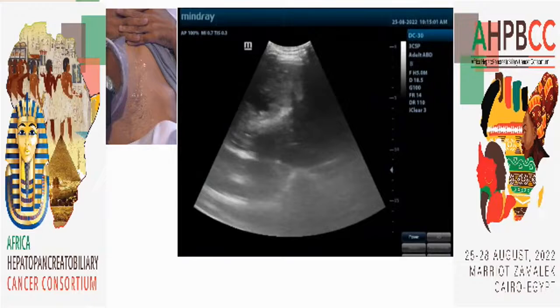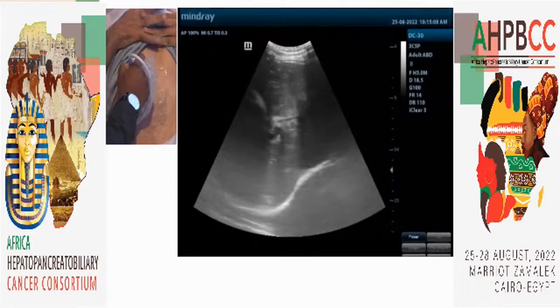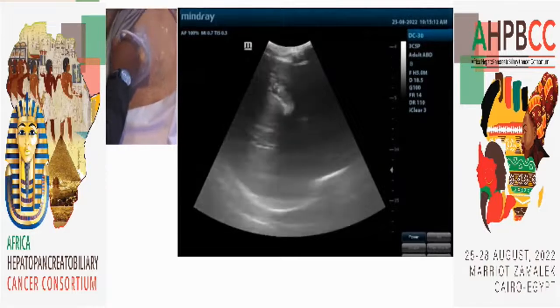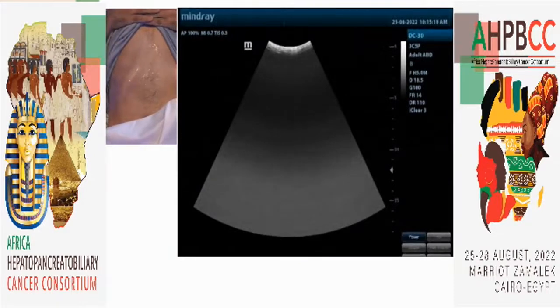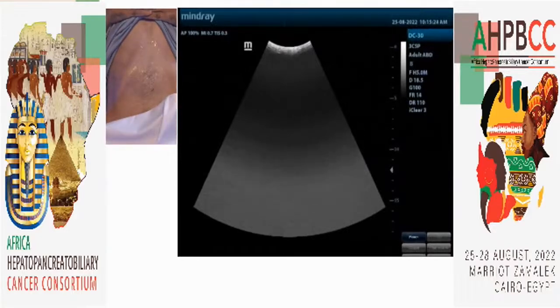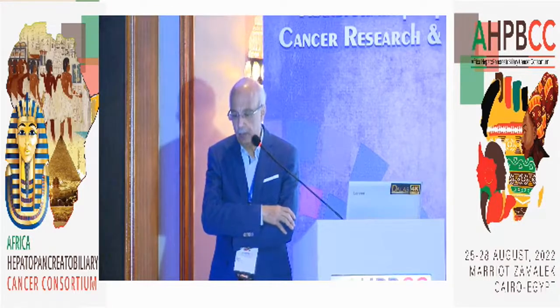Okay. Good. Have you succeeded in getting the focal lesion? We are going to put a score for you. Okay, got it? Good. Oh, great. Under supervision of Professor Yao, of course you got it. Okay, we can move to another case. Thank you very much. Professor Yao, thank you so much. Great demonstration. We would like to show you another case.